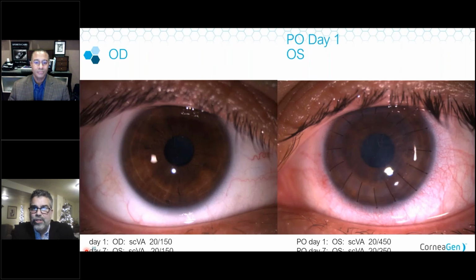Very good. Here's a question here. Have you tried a vision graft tissue in lieu of fresh tissue, given you don't need the endothelium? I have not specifically used the vision graft tissue, but we have used tissue that is months old. In some cases, we were saving these tissues from the DMEK grafts and then using those tissues for the anterior caps and ALK tissues later. And those grafts could be saved for a very, very long time. I have seen where we've sewn on ALK caps that are almost white like a sheet of paper with edema from just their age. And those corneas, you can watch them clear as you sew them on.